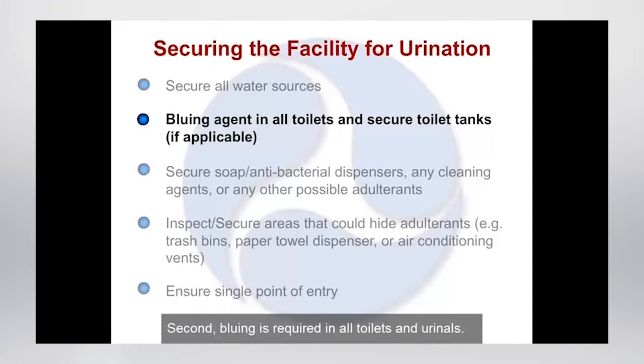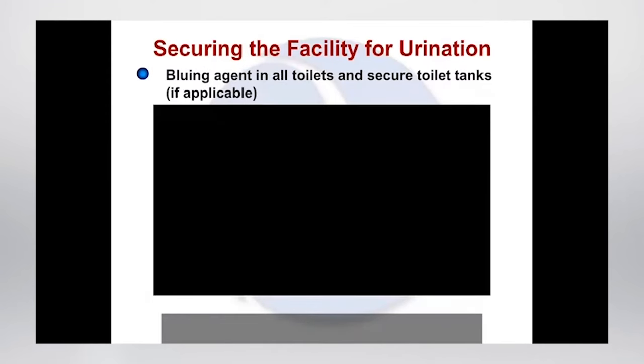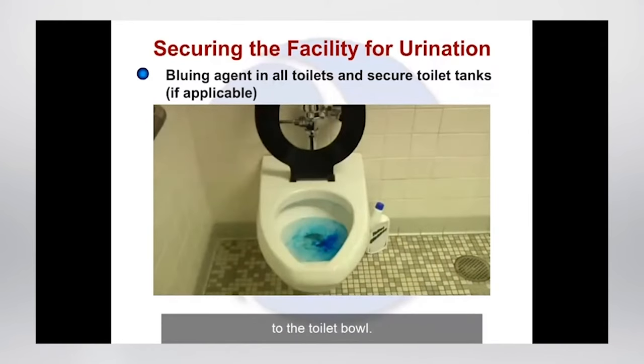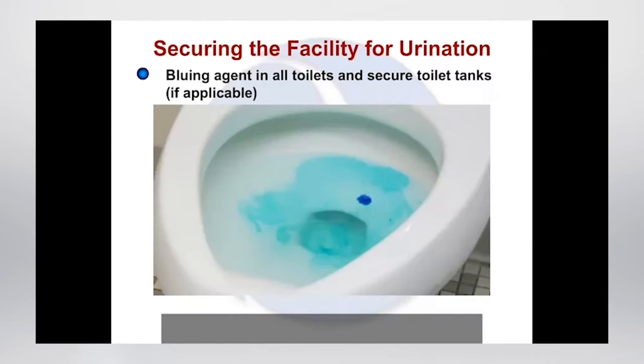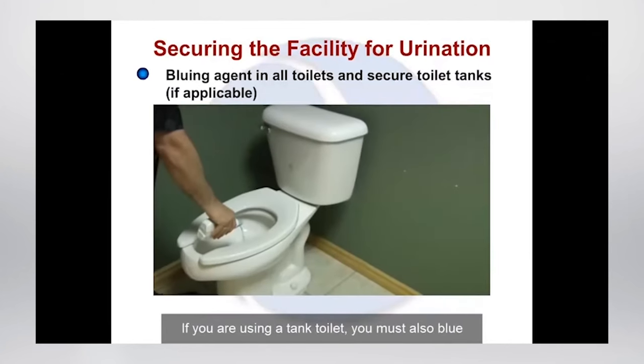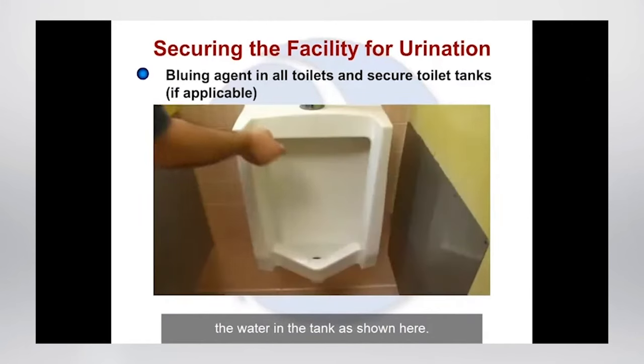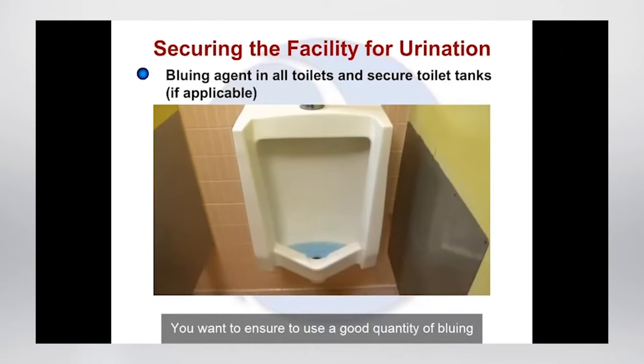Second, bluing is required in all toilets and urinals. If the toilet has a tank, it is required that you blue the tank as well and secure the toilet tank lid to prevent access. You must use a bluing agent — here you can see bluing agent being added to the toilet bowl. If you are using a tank toilet, you must also blue the water in the tank. You want to ensure a good quantity of bluing agent to get a deep blue color. The use of a bluing agent allows the collector to easily identify an employee's attempt to alter their specimen.